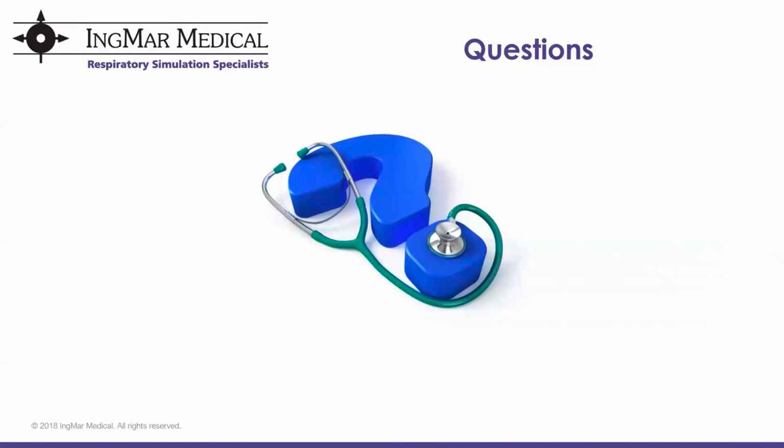Okay, so our first question is, where can I get these scenarios and what is the cost? So I do feel it's important to make it clear that these scenarios that we're talking about today do require the user to own our RespiSim system, which is based on the ASL 5000 breathing simulator.